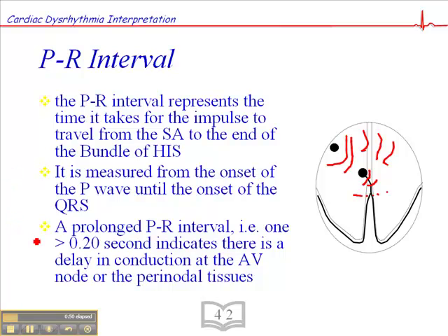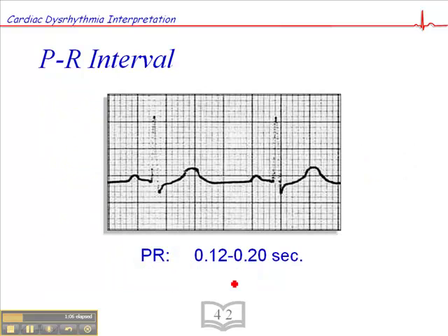A prolonged PR interval is one which is greater than 0.20 second, which is five small squares, and this would indicate a delay in conduction either at the AV node itself or in the perinodal tissue. A normal PR interval would be 0.12 to 0.20 second.